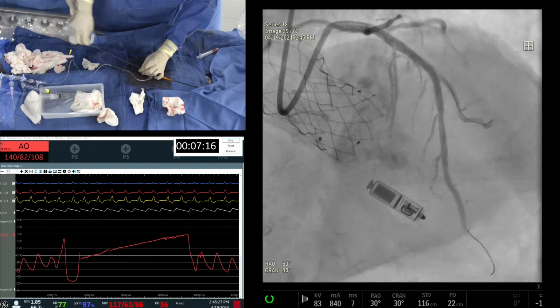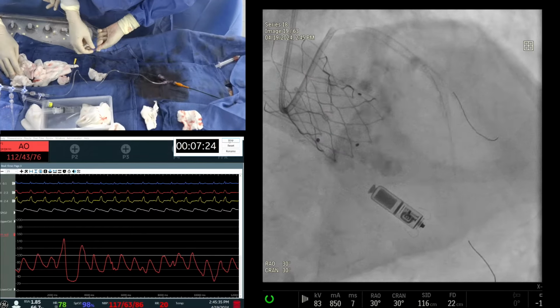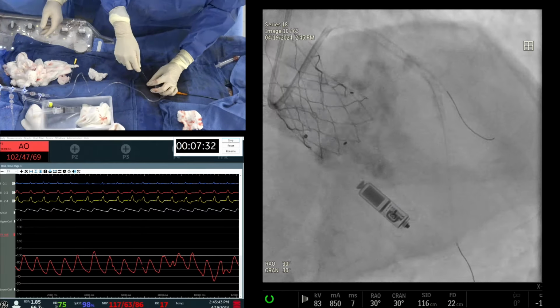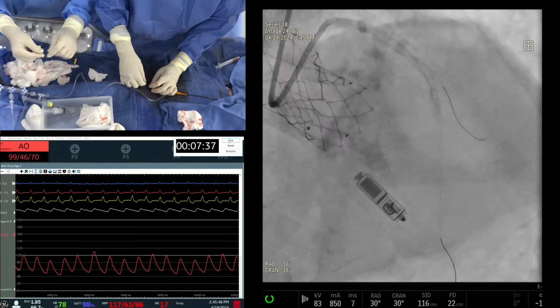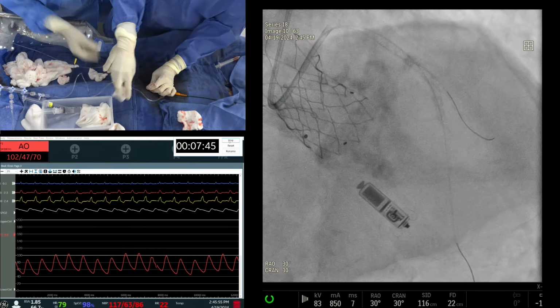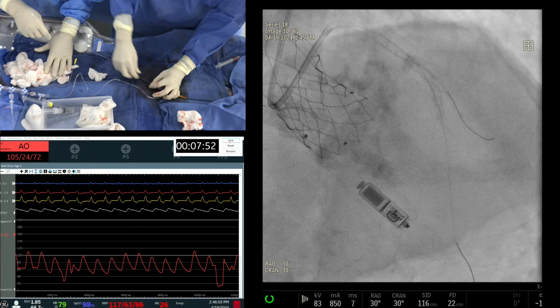I would consider rewiring into the diagonal at this point before your post dilation. I think the flow is also affected with this wire jailed in there. I would take a post-dilation balloon now. Don't pull the wire. Use that trapped wire to deliver your balloon, because of the mismatch. Then after it's delivered, you try to take the wire out. It also makes it less traumatic, because you'll suck the guide over the balloon and it's less traumatic. Good. Okay, we are dilating proximal with the 3.5. I think the proximal wire has come out, right? Diagonal wire? No. It's okay.